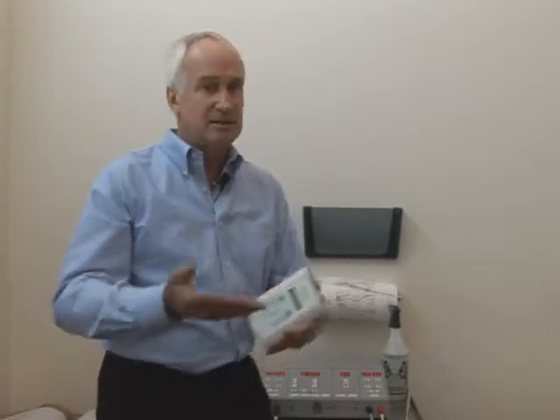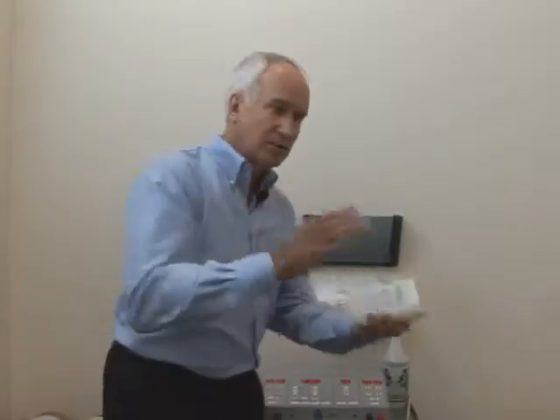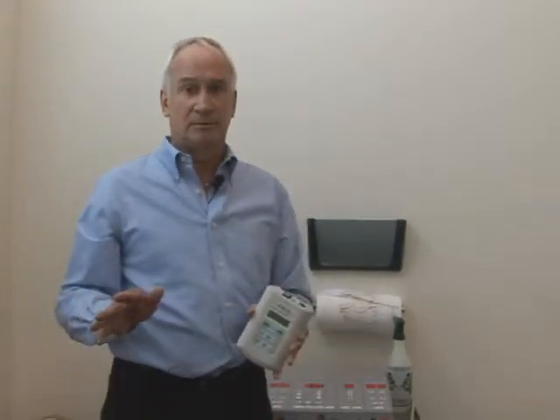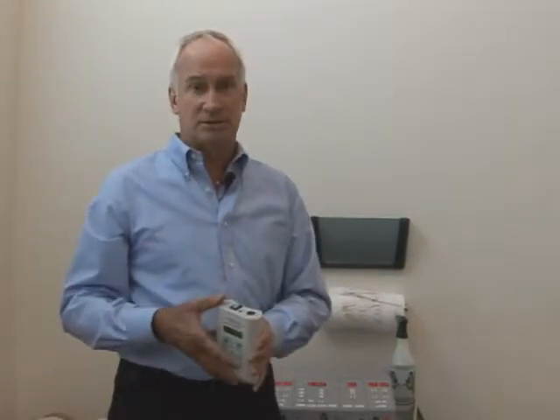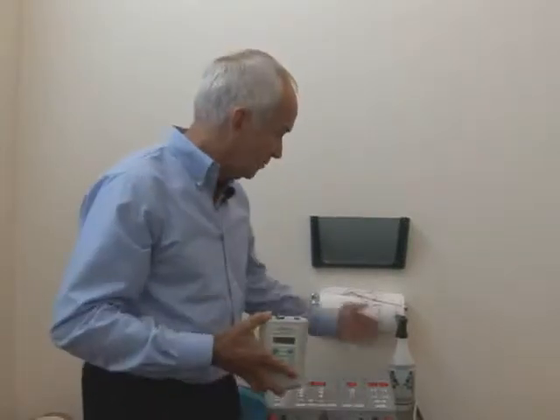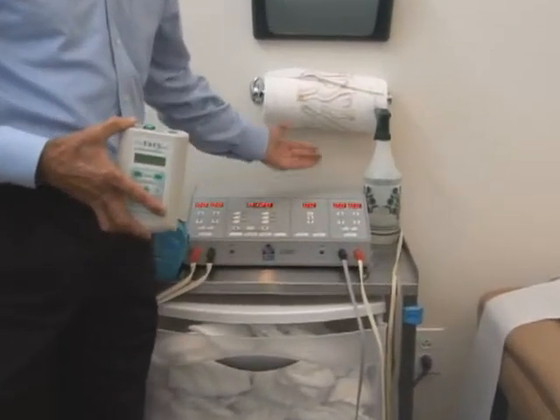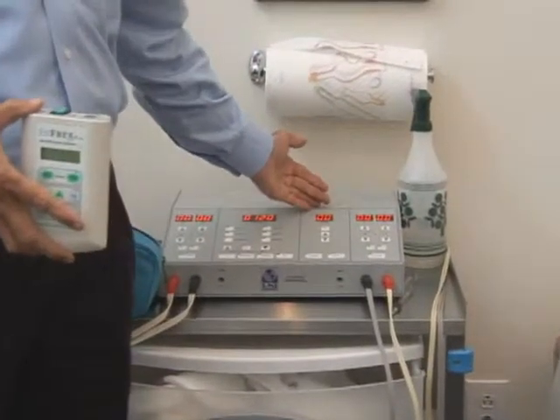Now, this may be some physiological changes, and by that I'm saying physical. I'm talking about electricity and the reaction of electricity in tissue and cells and chemical changes, or it may be just truly changing the chemistry so that the pain impulse is not felt. But there's no doubt there are so many patients that literally come in for a clinical interferential treatment and it has worked for over half a century.